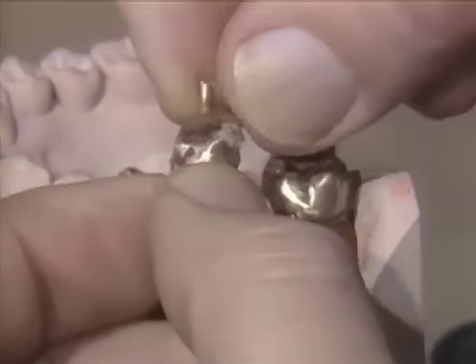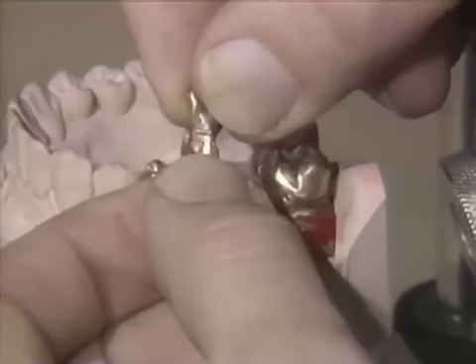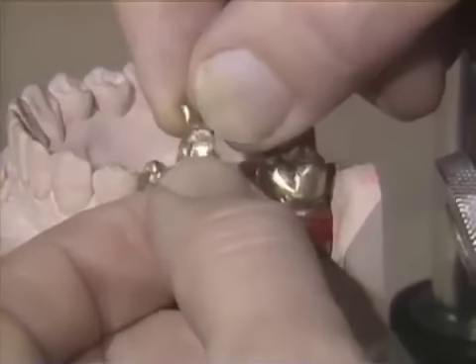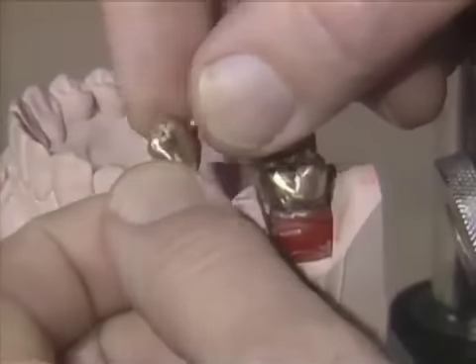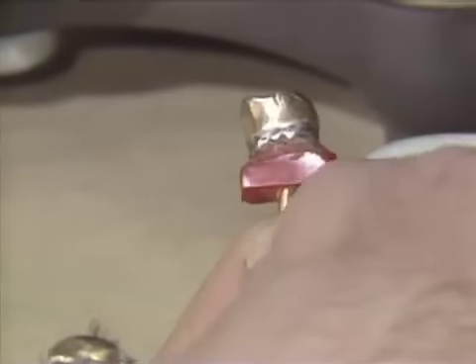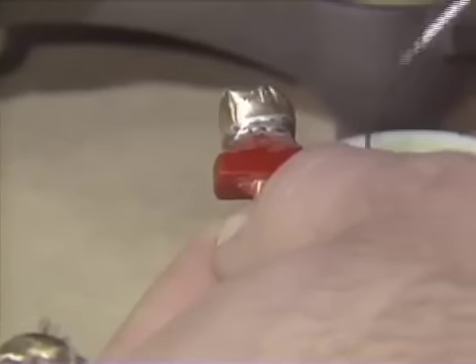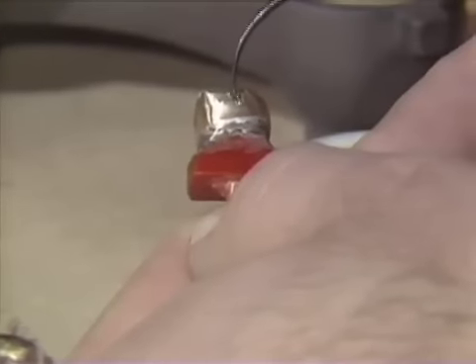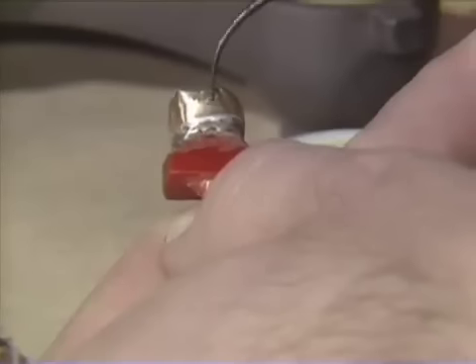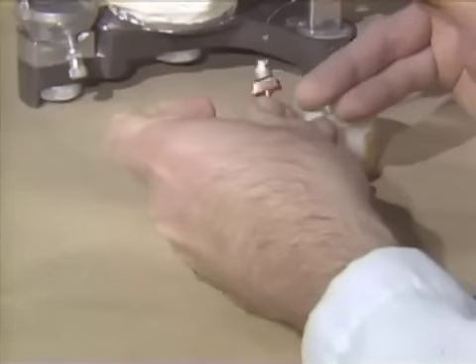If you feel you have to smooth the lugs to get any investment off, you can use a light sand disc. A safer method is to sandblast that area — it will leave a very dull look to the gold, but it will be very clean and will give a good surface to solder to. Take something like a Ward's Carver or your wax dropper and just put a very light coat of flux right into the lug and onto the proximal area that will have the solder. We are going to do that on both retainers and both of the lug areas of the pontic.